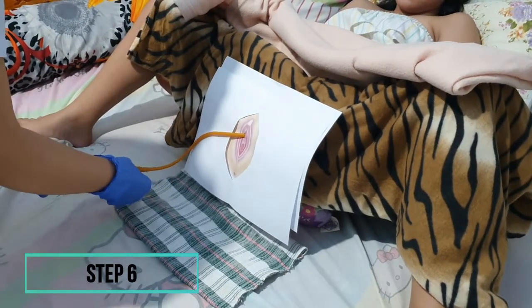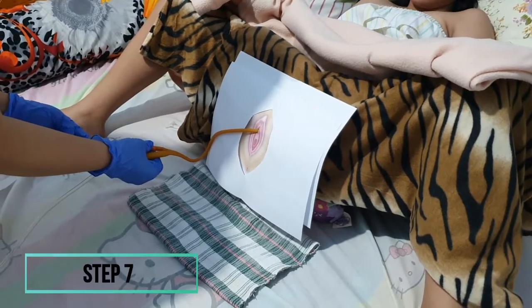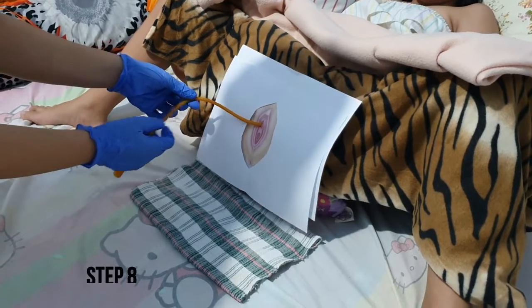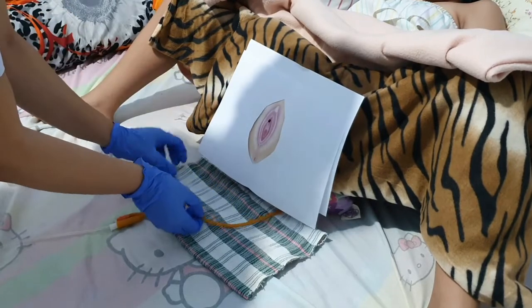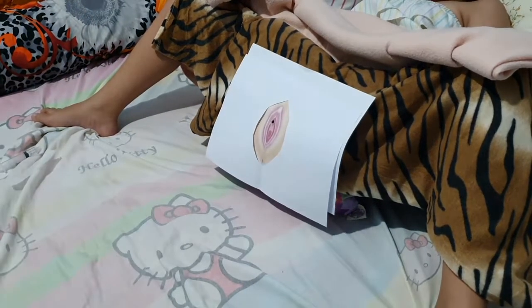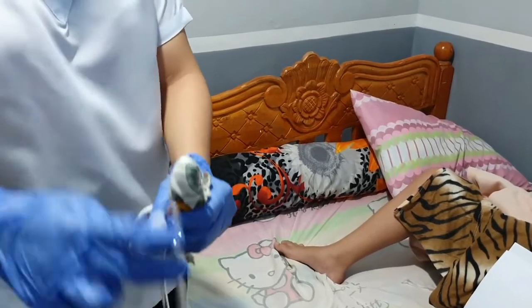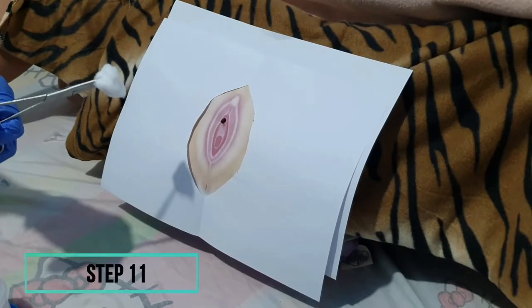Insert the syringe in the balloon port and drain fluid from the balloon. Verify balloon size on the catheter to ensure all fluid is removed from the balloon. Pull the catheter out slowly and smoothly. Wrap the used catheter in a waterproof pad or gloves. Unhook the catheter tube from the urinary bag. Provide perineal care as required and reposition the patient to a comfortable position.